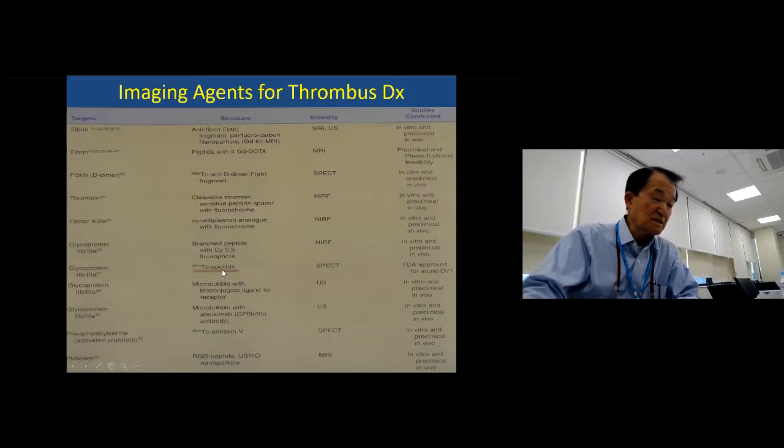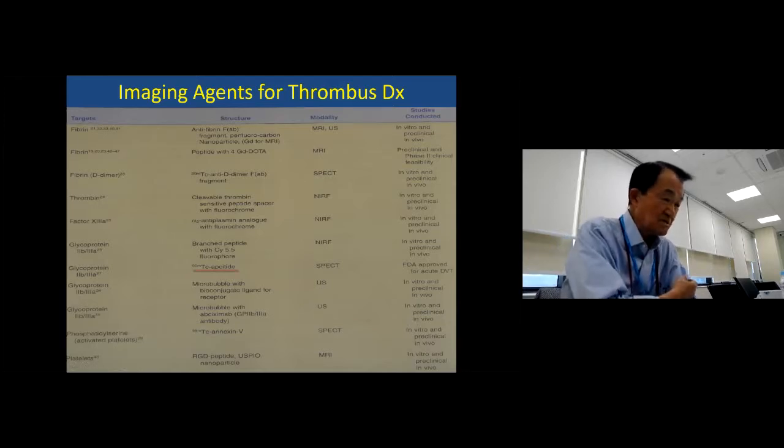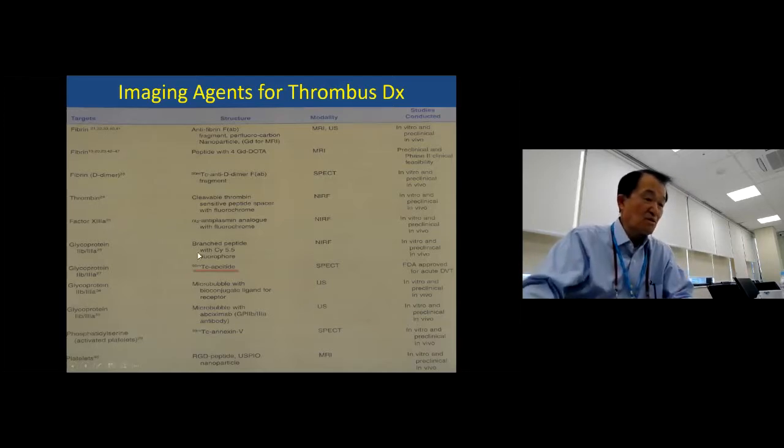This was very good in my personal experience, but the company was a small company. Before they got FDA approval, right after approval, the company went bankrupt and disappeared. So this kind of problem is very unfortunate for nuclear medicine people. That was very useful for this kind of thromboembolic disease.